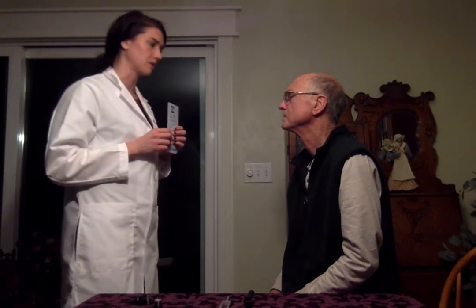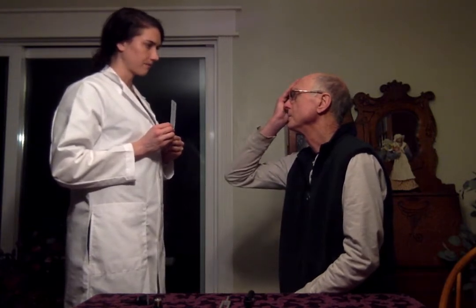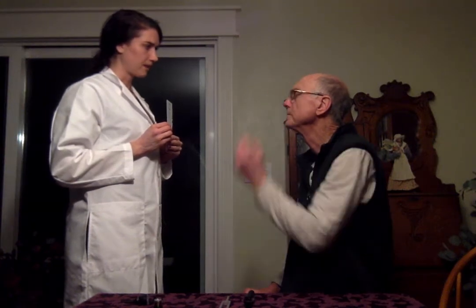So now I will be assessing his eyes. We will start with the vision test with the Snellen chart. I would normally be standing 6 feet away from you, but for the sake of this video, I'm just going to be standing right here. If this was a chart on the wall, you'd be standing 20 feet from it. I will have you cover one eye and read the bottom line. LTFPH. Cover the other eye and read the bottom line. LTFPH. And then both eyes open. LTFPH. All right, awesome. So here's 20/20 vision.